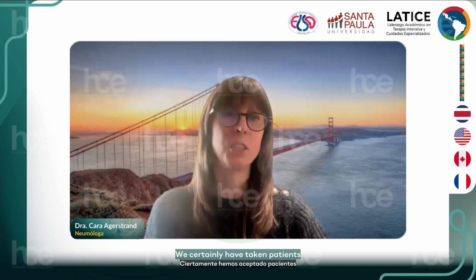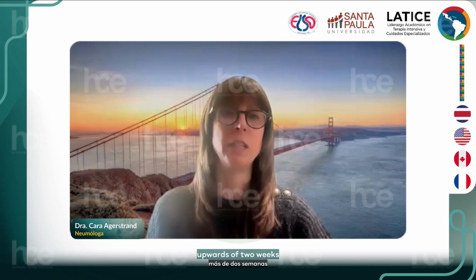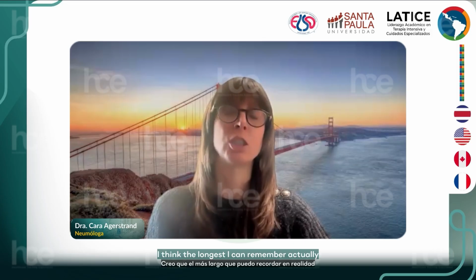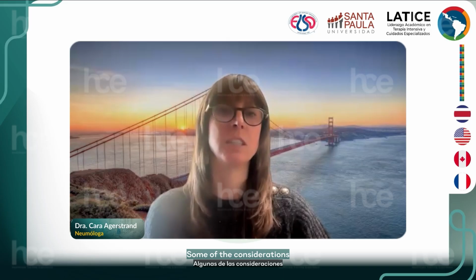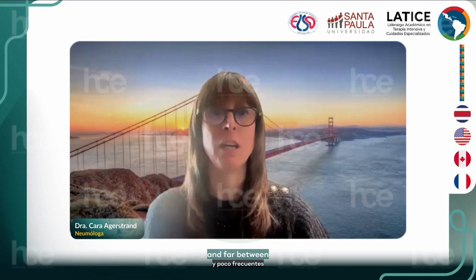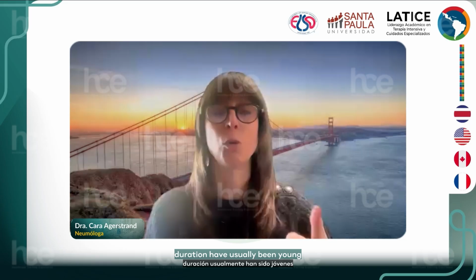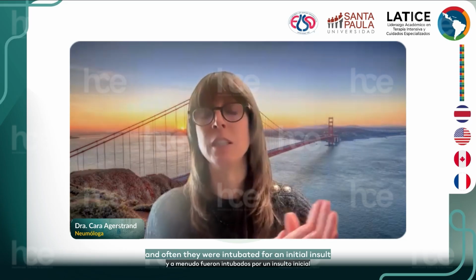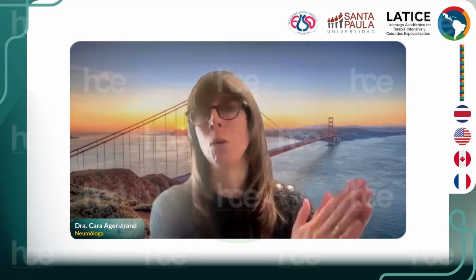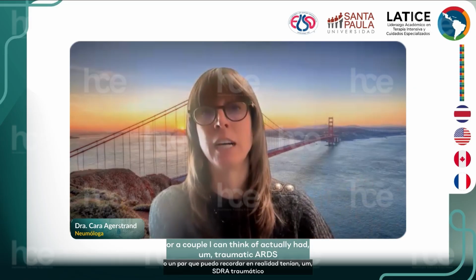We certainly have taken patients who have been ventilated for longer durations, upwards of 2 weeks. I think the longest I can remember was 23 days of intubation prior to ECMO. These cases have been few and far between, but the patients that we have placed on ECMO after this extended duration have usually been young, with single organ failure, and often they were intubated for an initial insult, maybe a pneumonia, or a couple I can think of actually had traumatic ARDS.